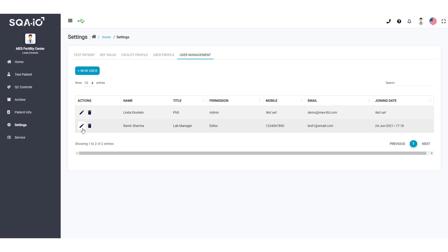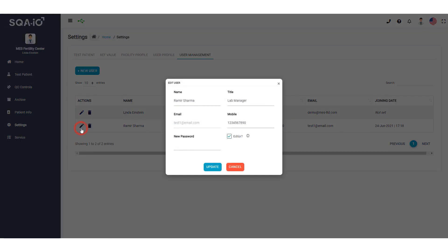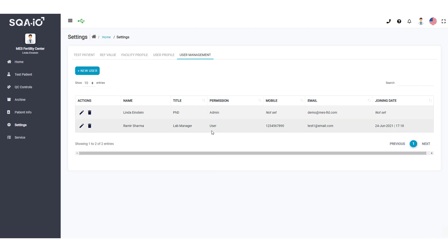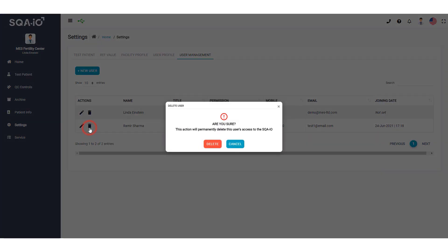Click here to update or change the status of a user. Delete a user and disable their access to the SQA-IO website by clicking on this icon. This action cannot be undone.